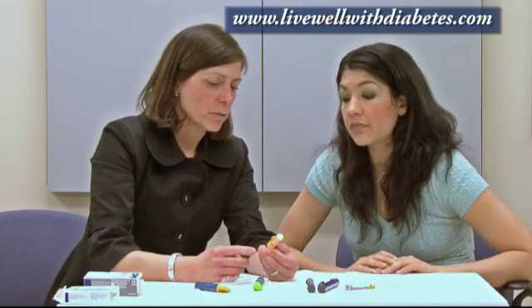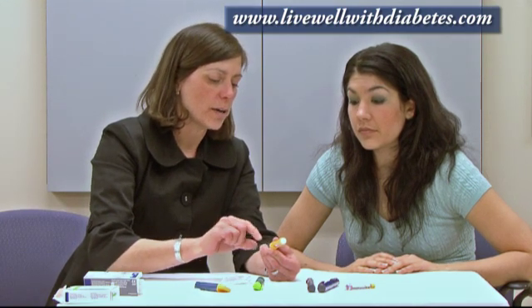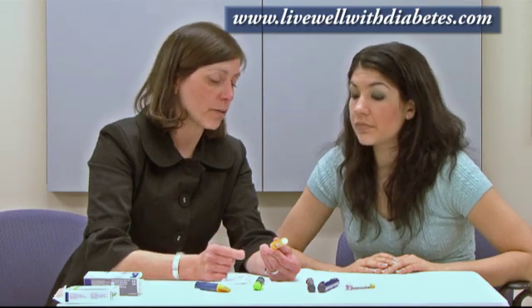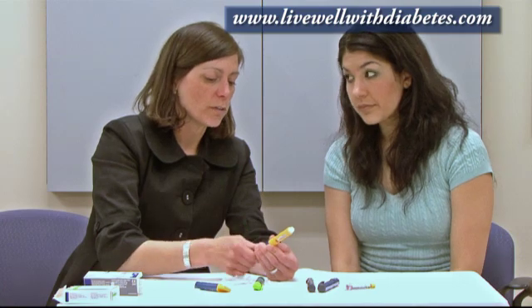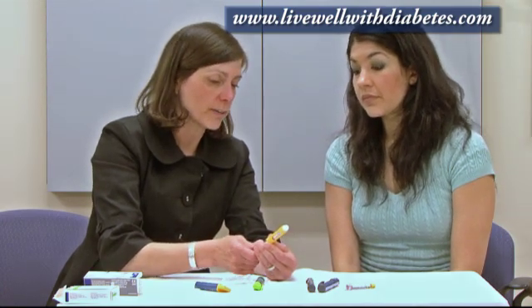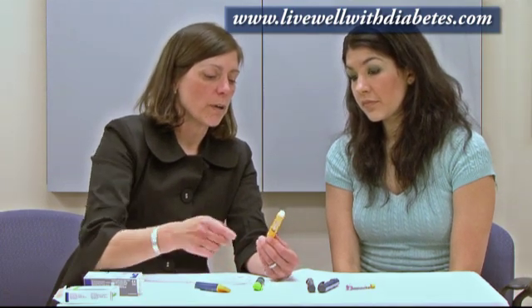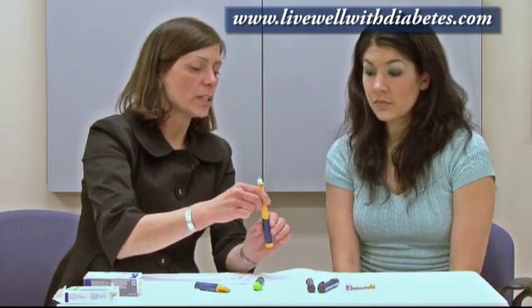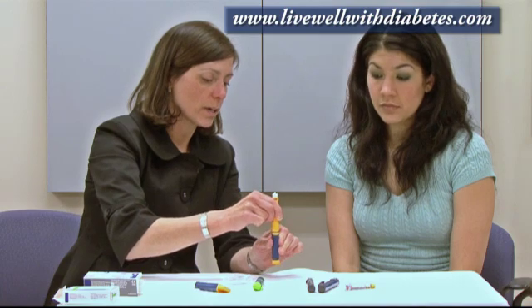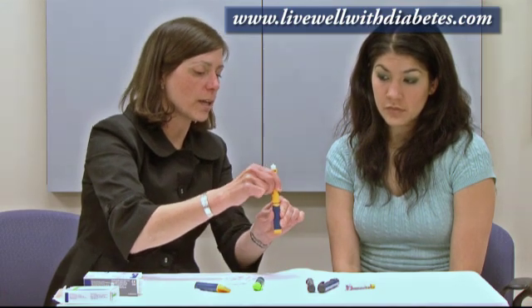The key features of the Novolin Junior Pen are: you can change the dose by half-unit increments. Each time you make a change in dose, you can hear and feel a click. Another key feature is that if you dial the wrong dose of insulin, you can reset the dose by pulling the two pieces apart and pushing the button against the table, then letting go.